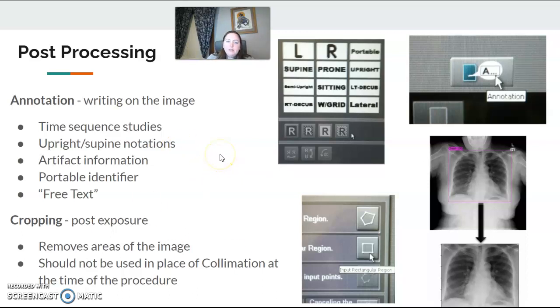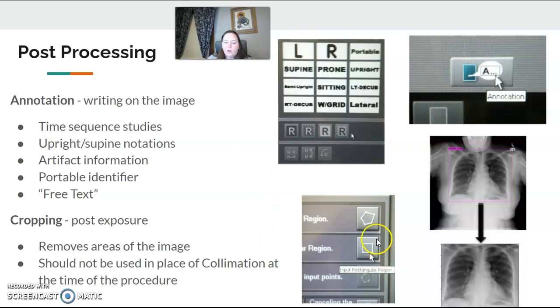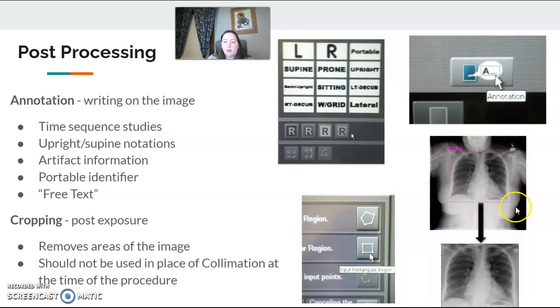Cropping is electronic collimation kind of post-exposure. Depending on your machine, you can select a square — or what I call 'connect the dots' — and click into your picture and crop out certain areas.